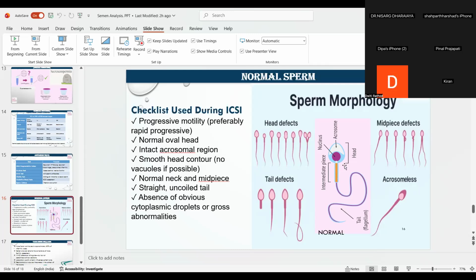Yeah, we are here together. The question is that we have many sperm in a single slide. Out of that, some are more progressive, some are less progressive. So, is there any criteria? Because this lecture or discussion we are taking on a motility angle only. Then I think you answered it well. Okay. Thank you, sir.